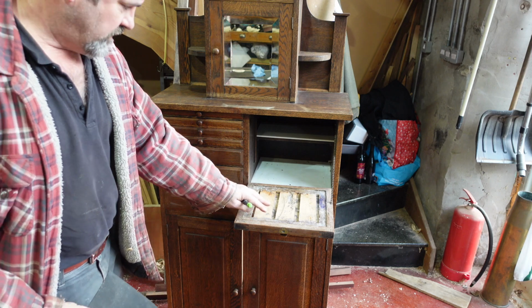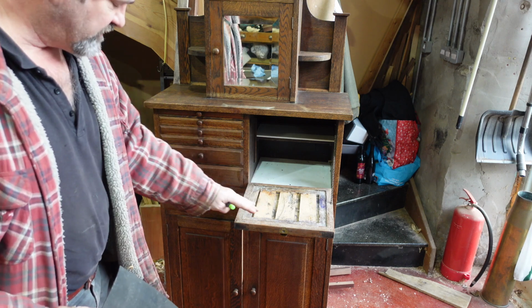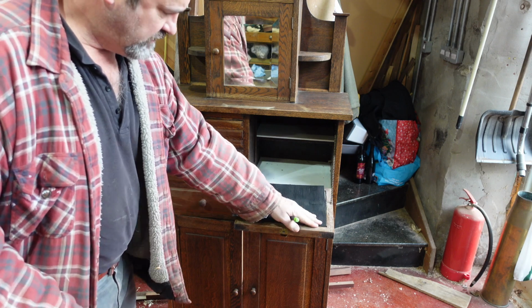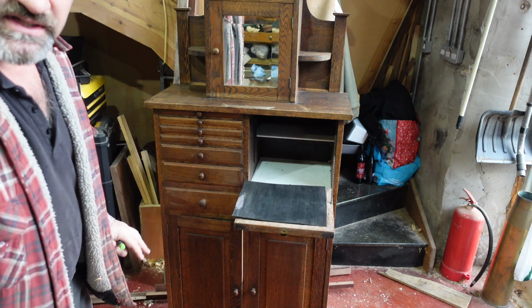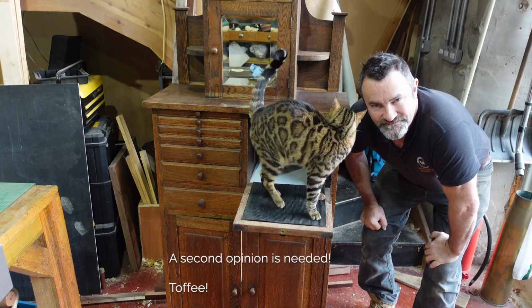So I've cleaned this up. I'm thinking this might be used to put drinks on, so I could put a piece of wood in there. What I've got is some rubber matting, and I'm just going to see what it looks like if I cut this to size and put it in. So I'm not 100% sure yet, but I'm going to cut it to size and see what it looks like.